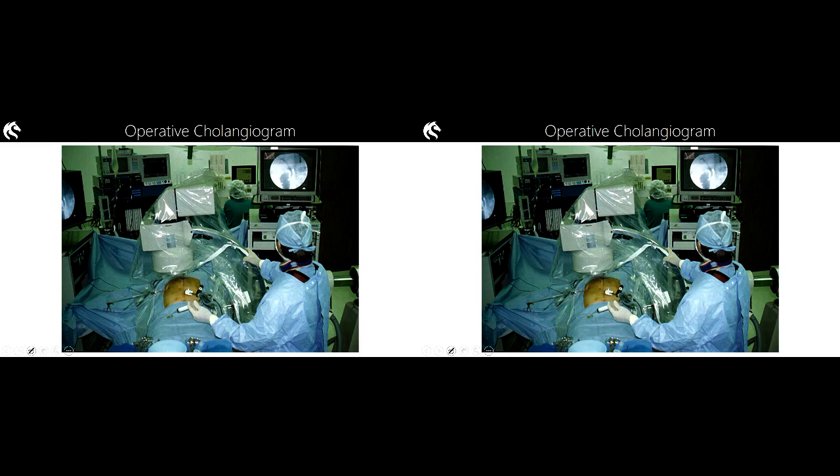Okay, and the gallbladder removal process is something I just want to touch upon here for a little second. An individual gallstone, we might take out with a basket or a balloon. We might assist that process by cutting that sphincter open, and if we have a long-term need to push those walls of the vessel out, we might use a stent. All right, now I want to introduce a few concepts here, but I'm going to expand upon this procedure next week when we have our lecture on operating theatre stuff.